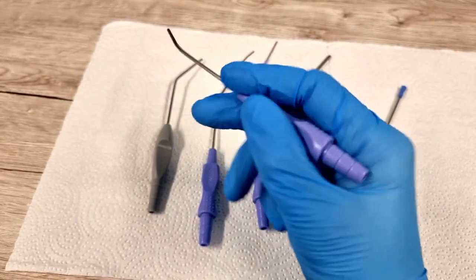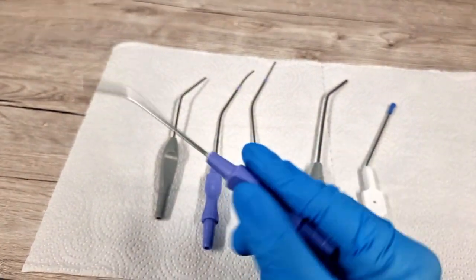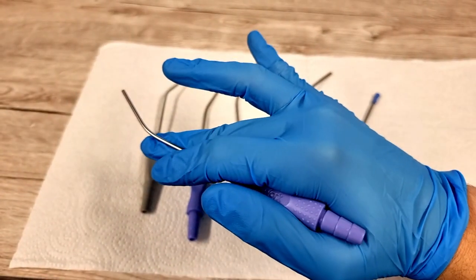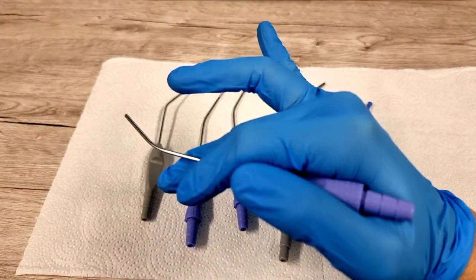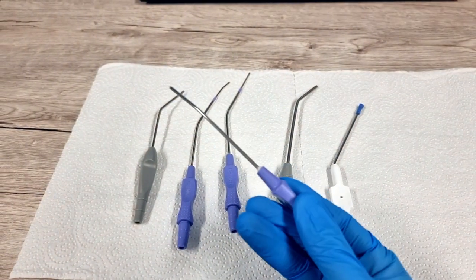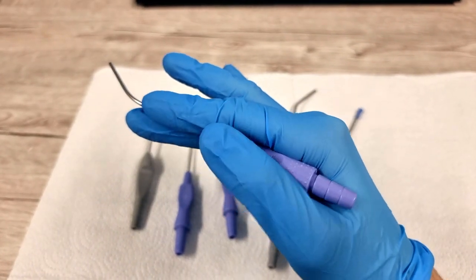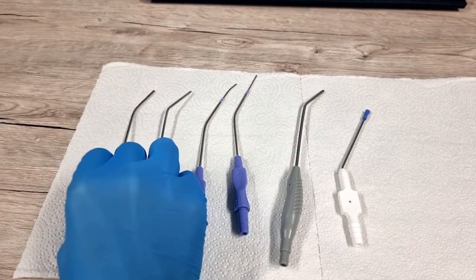I don't know if you guys know, but very rarely, in fact never, will I hold it by the hand like that and go into the ear. I always hold it like a paintbrush. This just feels super comfortable, and I can do very fine movements. It allows me to extend out my pinky to touch the patient's face. So if they jerk or flinch towards me, my hand moves with the patient, because my pinky is touching their face. If I was holding it like that and the patient moved towards me, the tube would just ram down against their eardrum. So this is a safety thing, but it also feels very natural. I like these purple ones here.